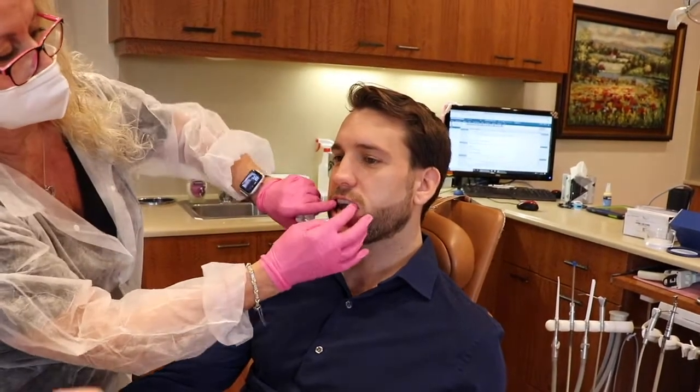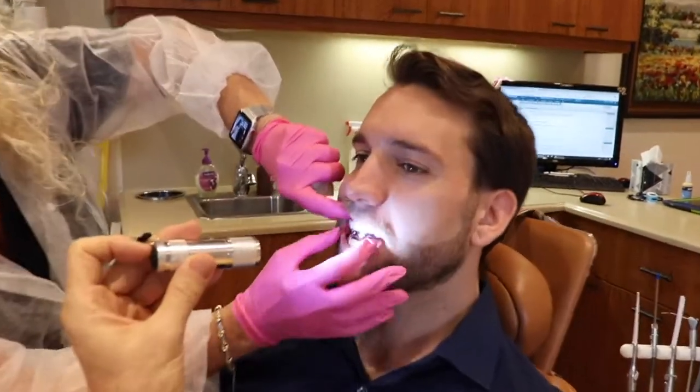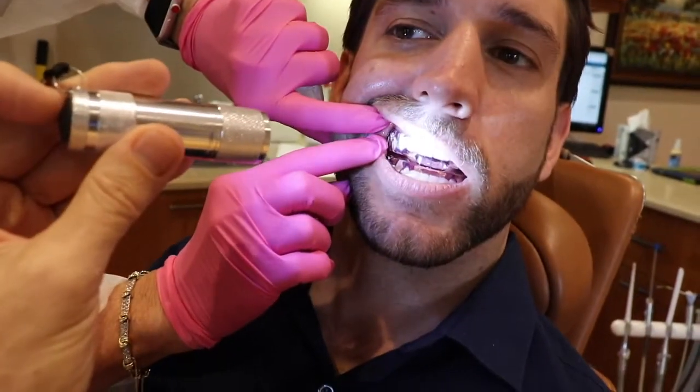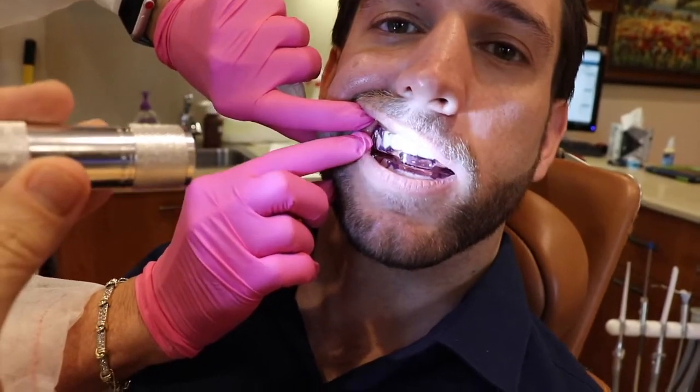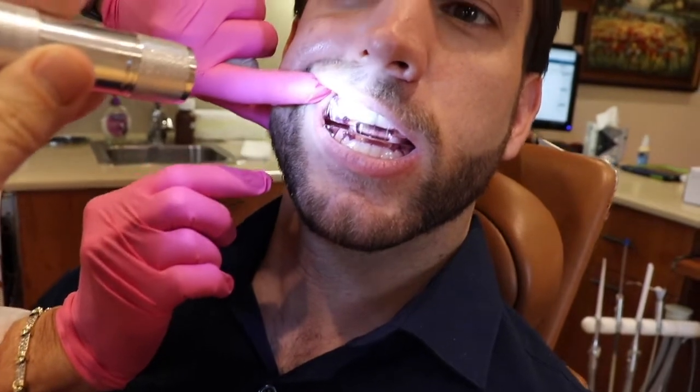And you have that on both sides. You also have — Leah, can you lift them up? — what Somnomet is building into this: rubber band elastic holders. There's a little clip right there, and that is for the elastics. We use elastics in cases where we want to promote lip closure.